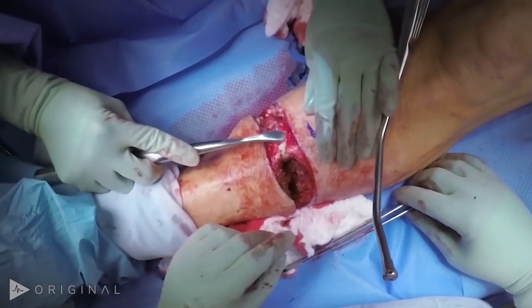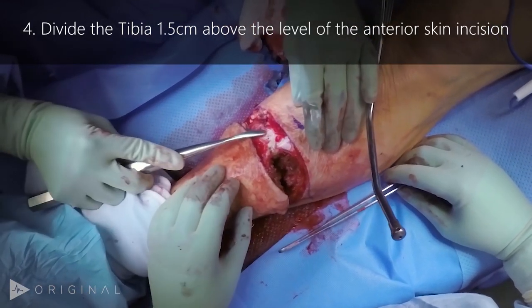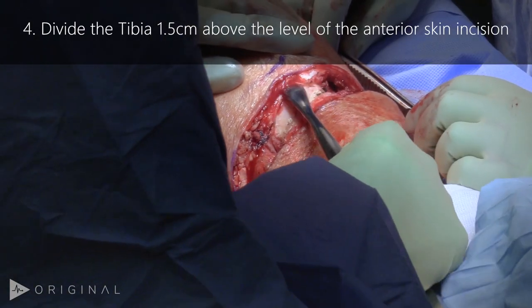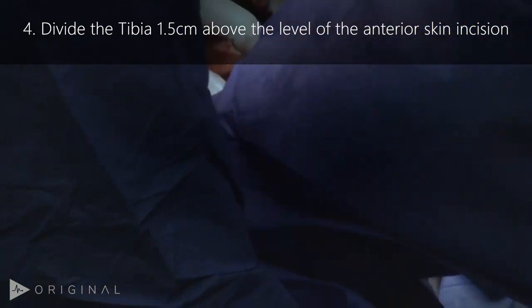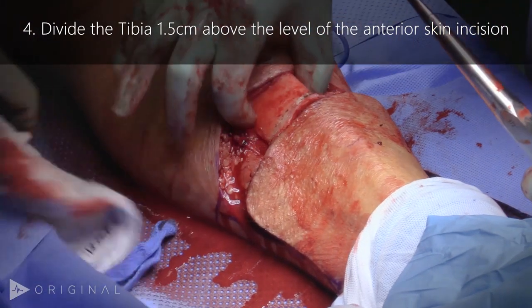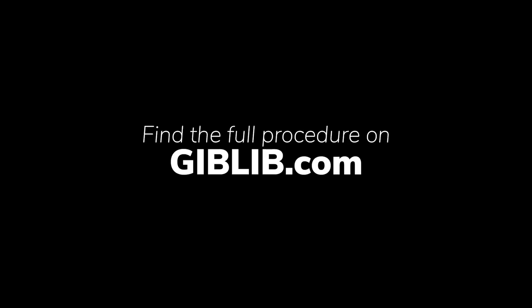With the anterior compartment resected, the tibia is nicely exposed. To begin the transection of the tibia, the periosteum is removed circumferentially. The tibia is then cut approximately one and a half centimeters above the level of the original incision. An Army-Navy retractor will be placed behind the tibia prior to sawing through it to elevate the bone from the soft tissues behind it.